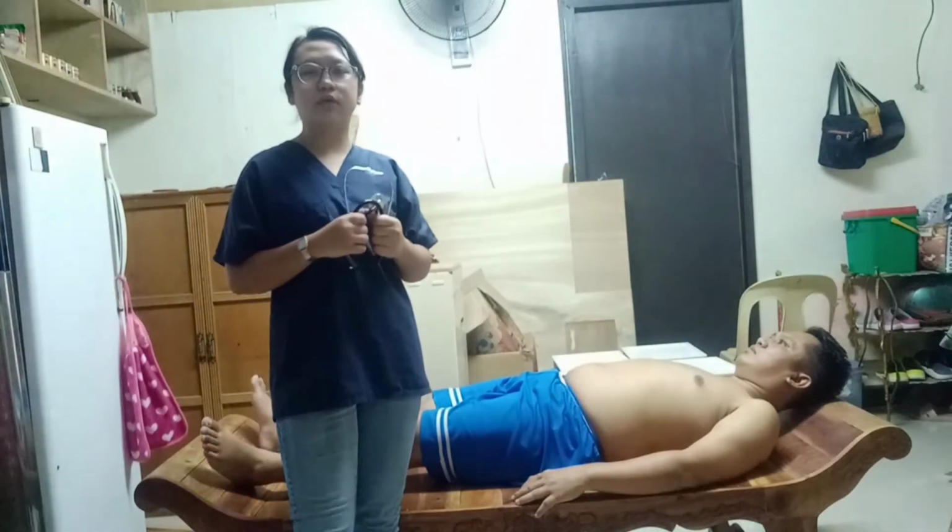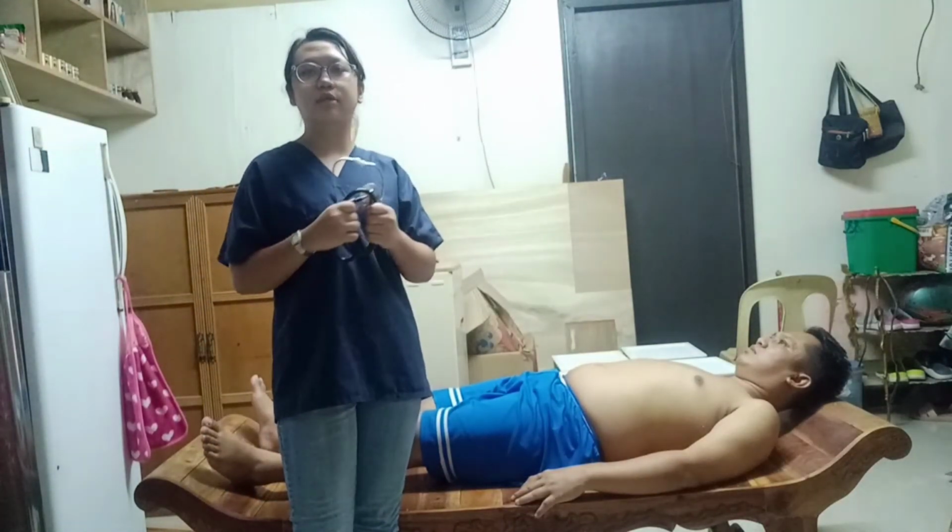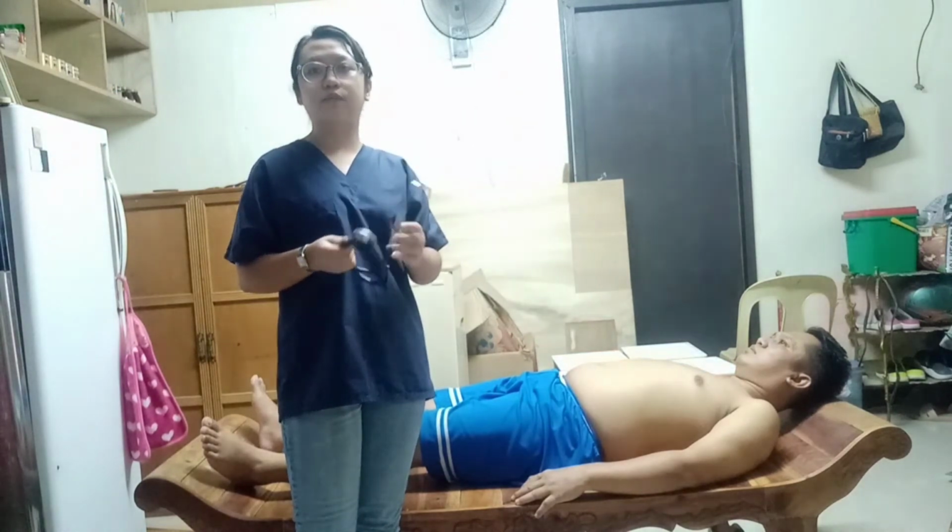Now I'm going to auscultate my patient's apical pulse while he is on a supine position for one full minute.